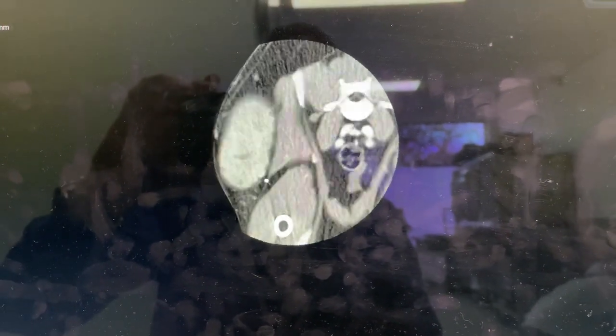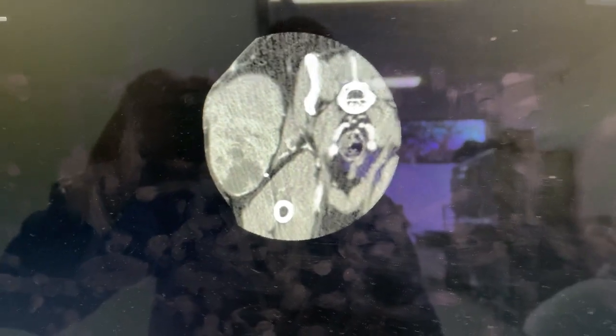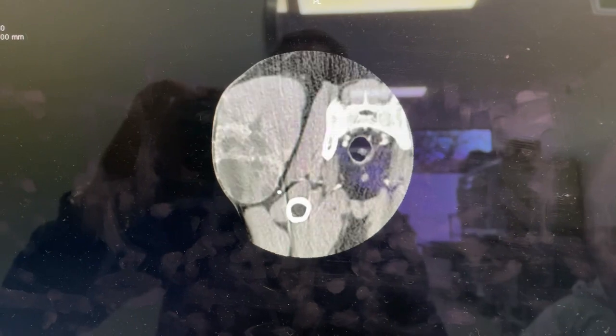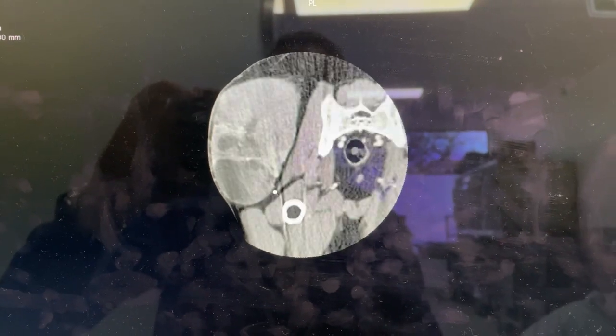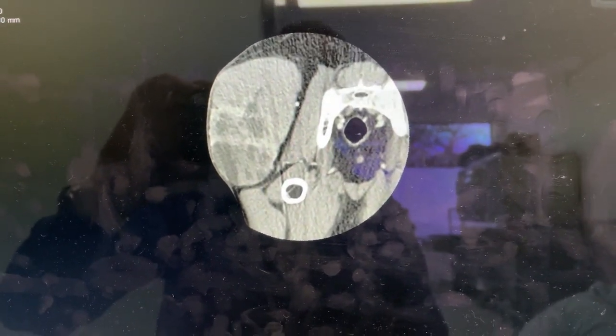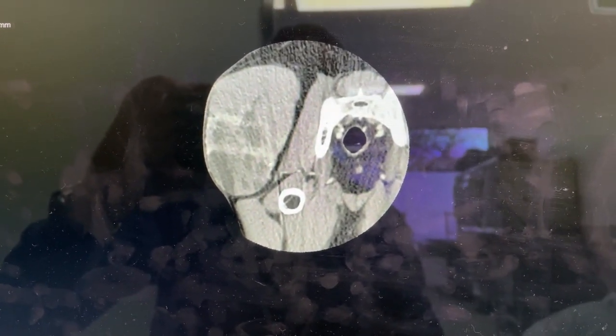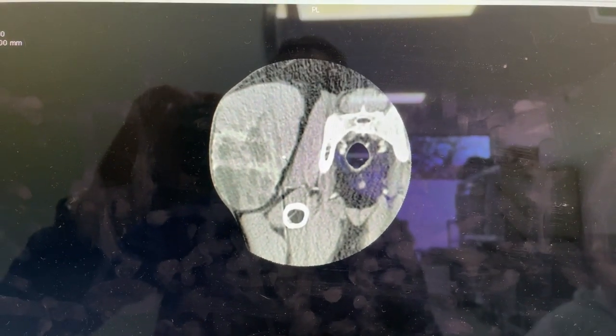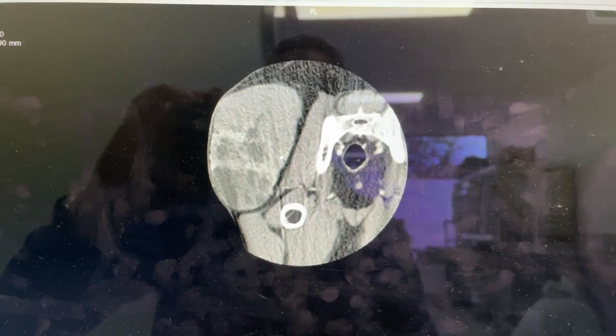So you can see that this mass is very well circumscribed. It was biopsied as a grade one or grade two soft tissue sarcoma. You can see that there's even a fat layer between the tumor and the muscle.